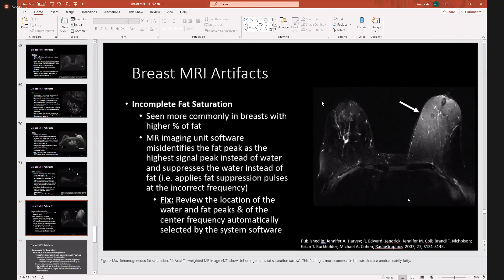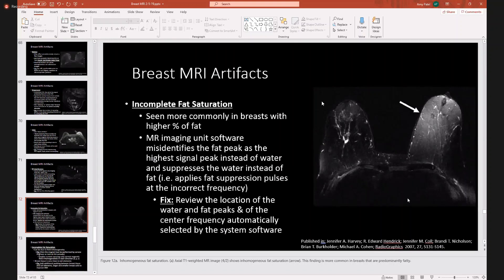Incomplete fat saturation is seen more commonly in breasts with a higher percentage of fat. Basically, the MRI imaging unit software misidentifies the fat peak as the highest signal peak instead of water, and then suppresses water instead of fat. To fix this, review the location of the water and fat peaks and the center frequency. Your system software can automatically do this — you just need to make sure you are suppressing the fat instead of the water.